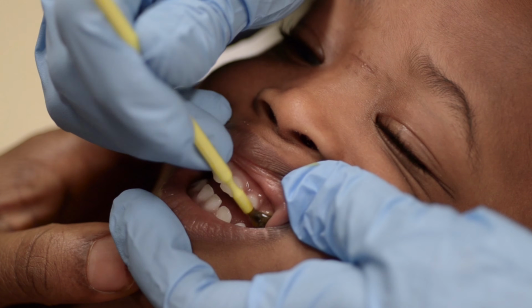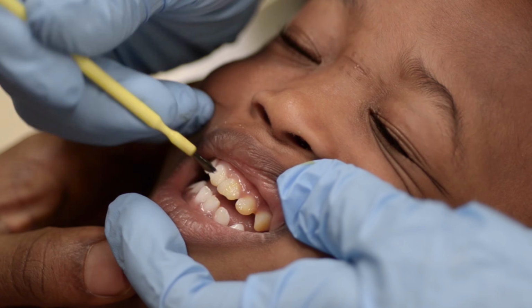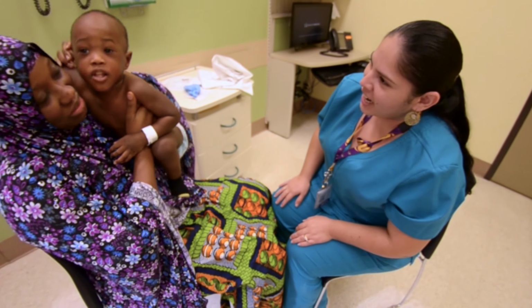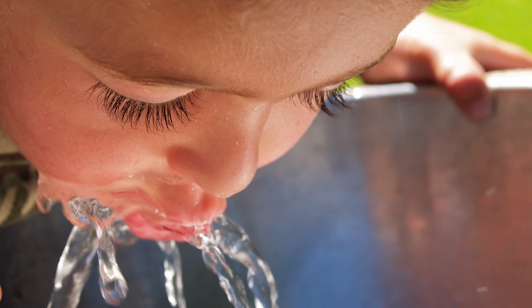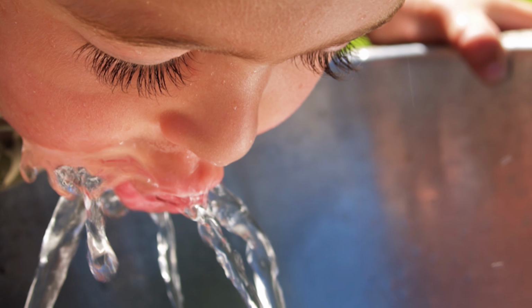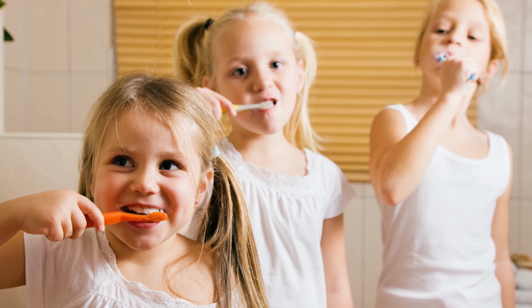You only need to apply a thin coat of the varnish, and you don't need to use all the varnish provided. That's it! Tell the caregiver that the child can eat and drink warm or cold liquids and soft foods right away. Avoid sticky, crunchy foods and hot liquids for 24 hours. Don't brush or floss until the next day. The slight yellow discoloration of the teeth will come off with the next toothbrushing.